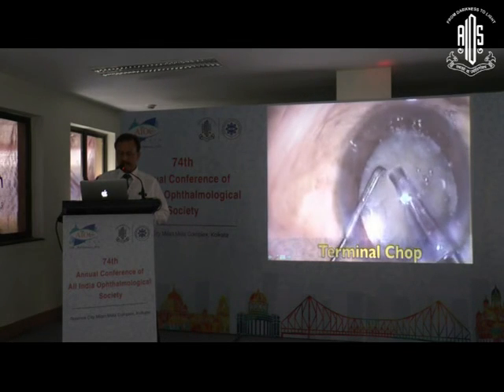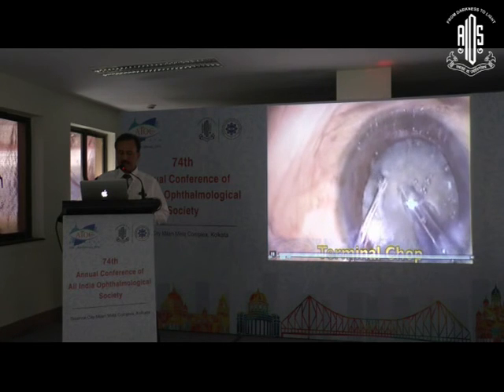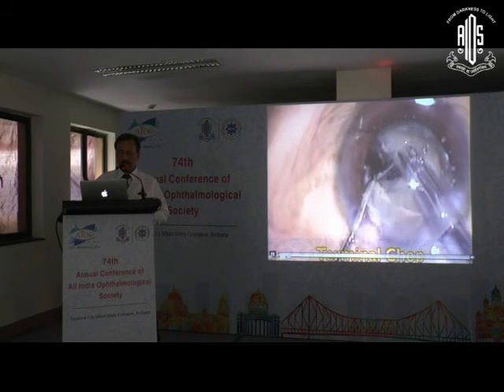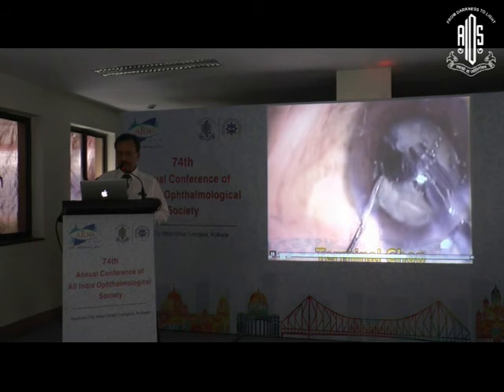This is a small video. Look at the movement of the phaco probe, it has to go to the periphery, and then it has to be engaged here, and then both instruments have to go away from each other, the lateral separation, and you get the complete segmentation.